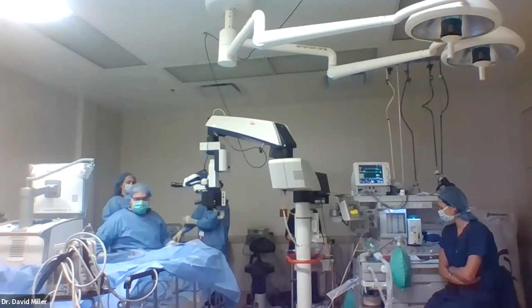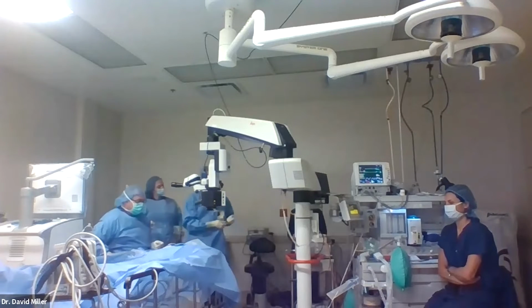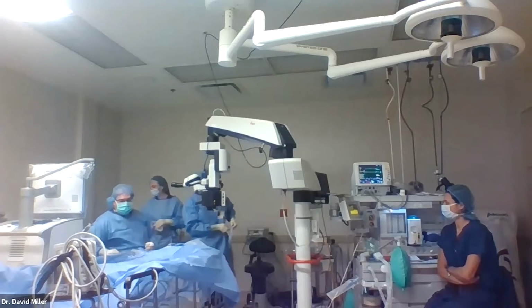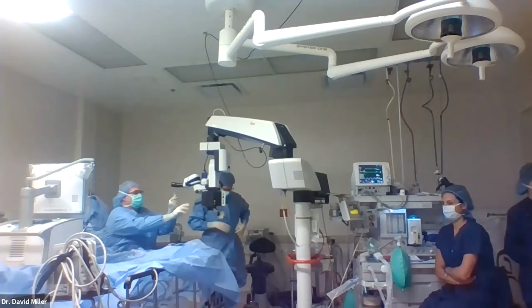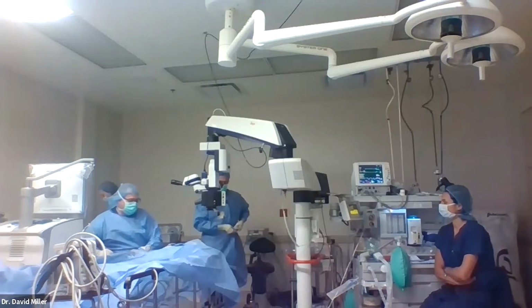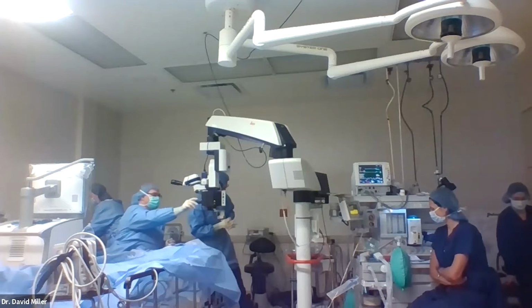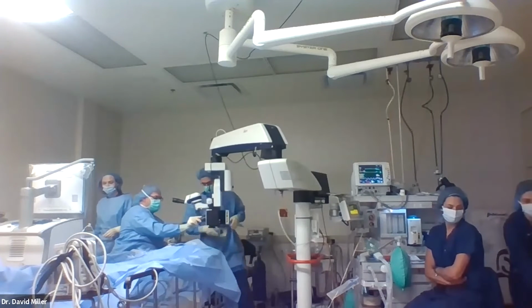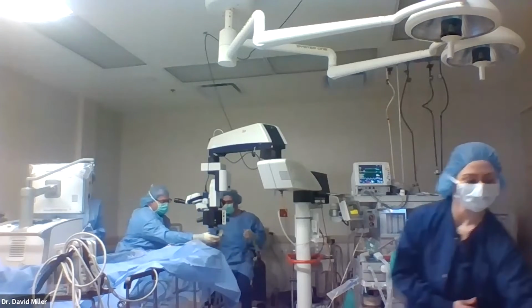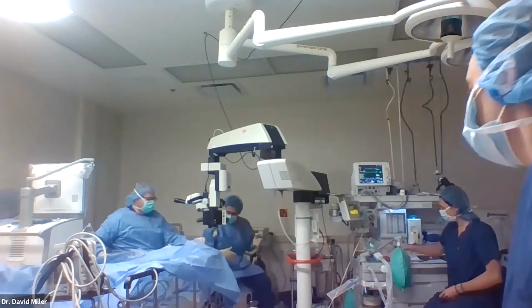My partners, I have to thank Dr. Hall for setting our patient up here, Robert, helping us today and volunteering to be in the video. These retinal detachments come in pretty much every day to our practice, but you never know coming off the weekend, and I don't want to get skunked and have no case for you guys. We ended up with about 4 retinal detachments coming through today, so plenty to keep us busy this morning.